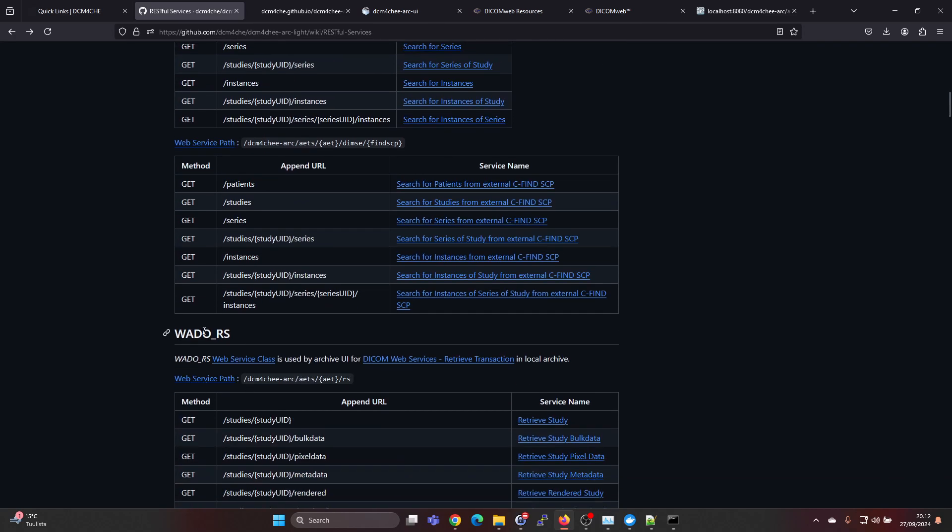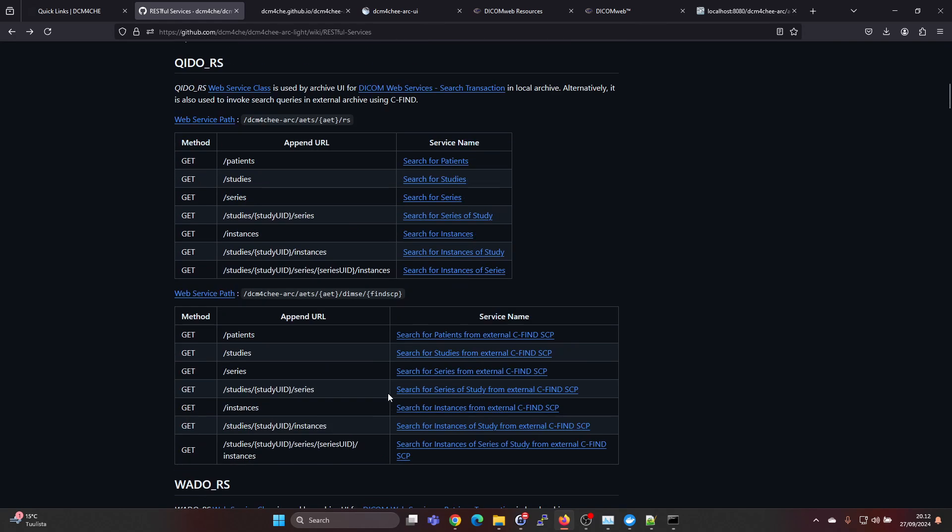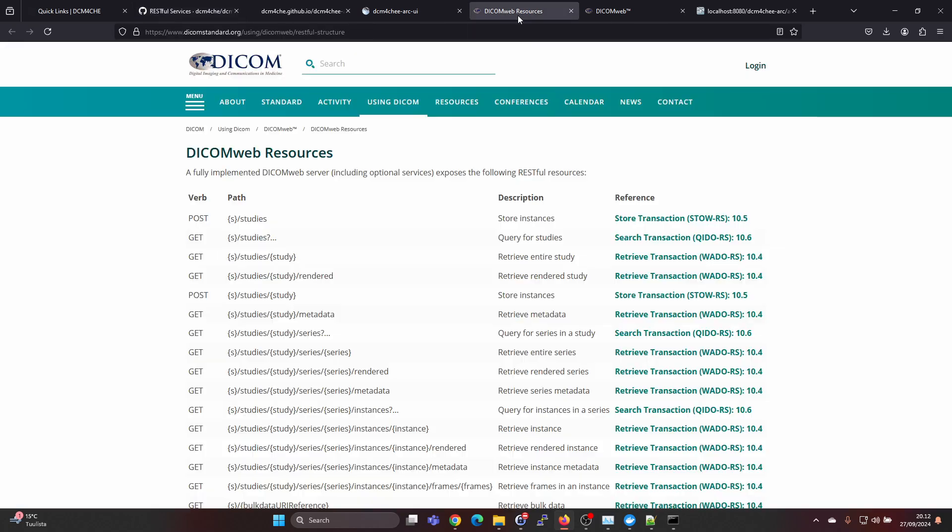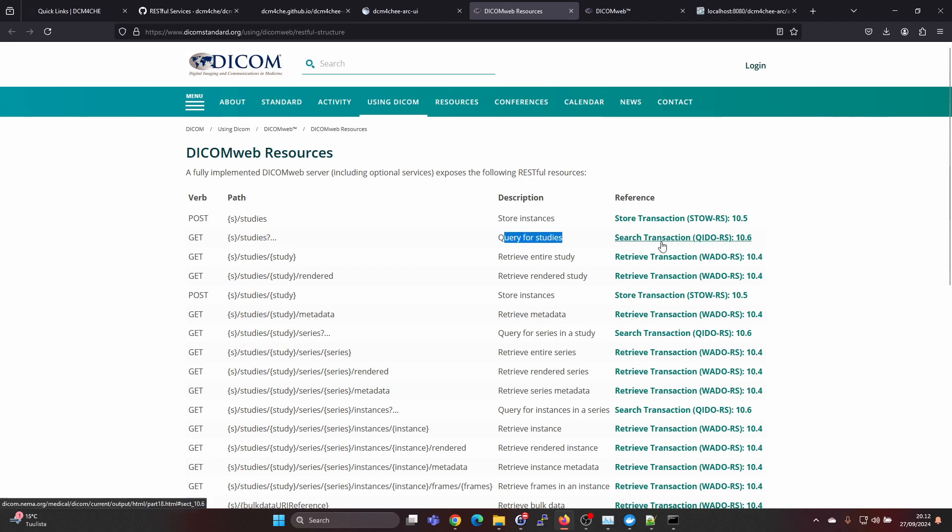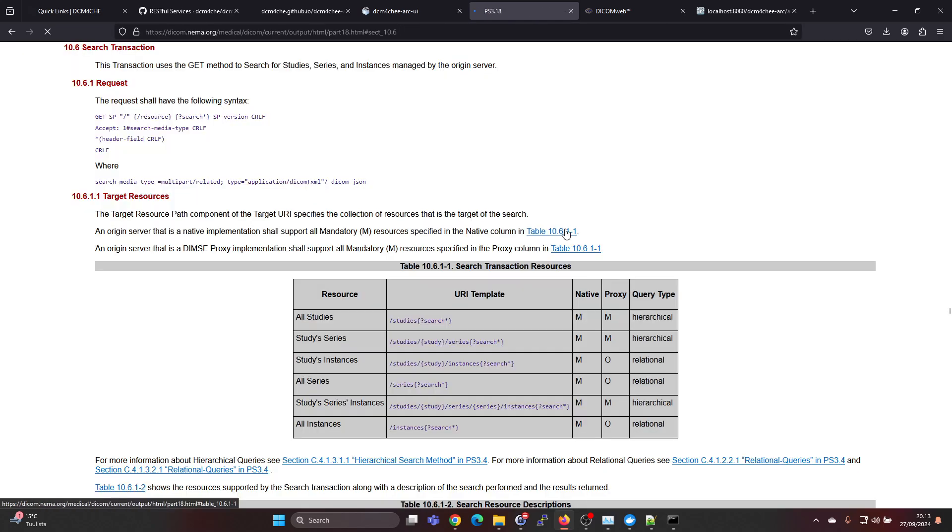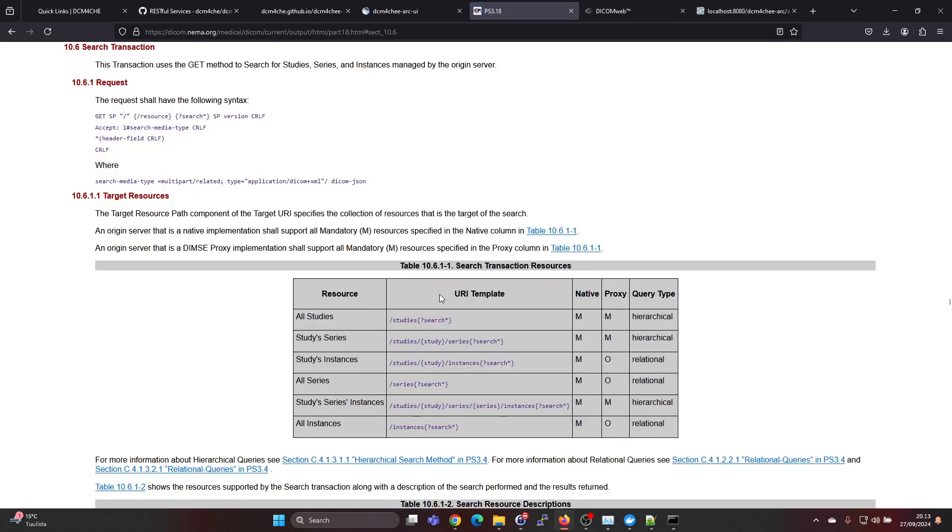And also the other RS queries. If you check the DicomWeb standards page for the resources, you can see that for example these studies is the query for studies and there is more documentation on the standard. For all studies you would put slash studies, and for series you would do this and so on.